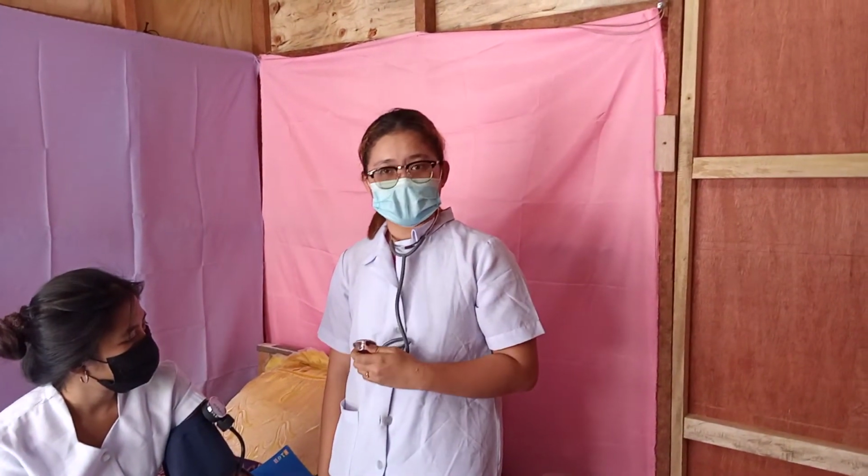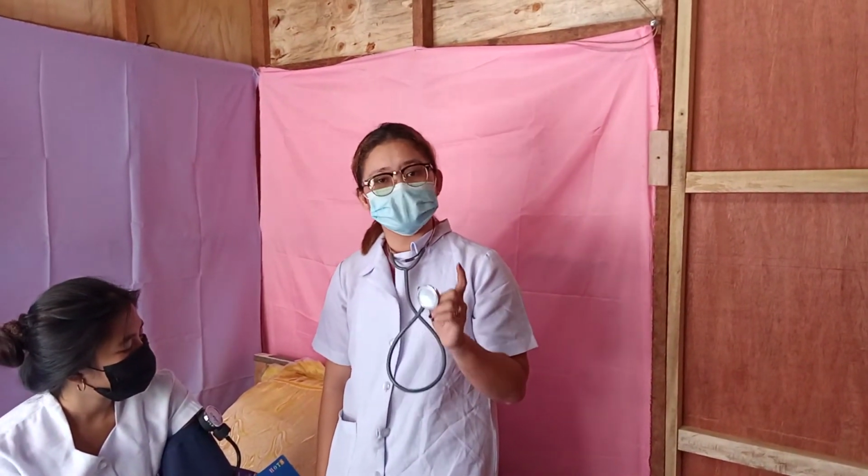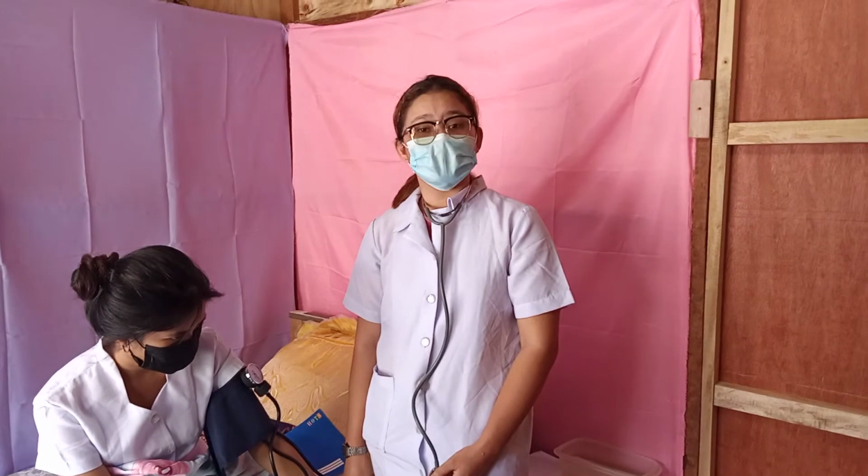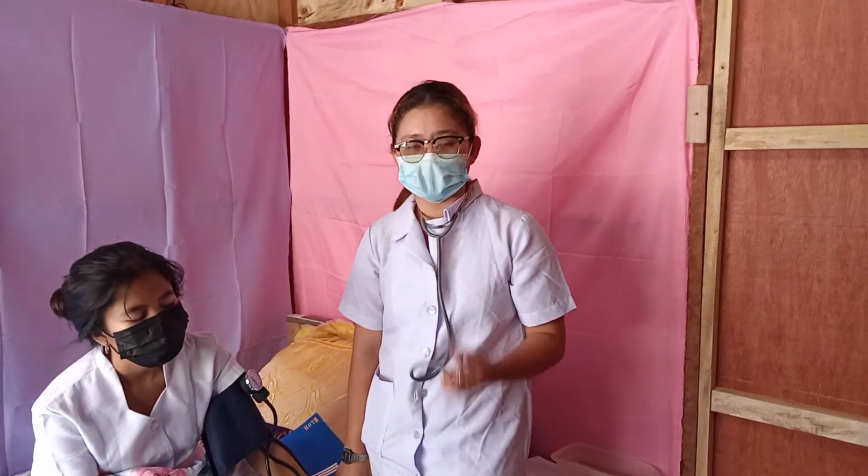After that, listen to the first distinct loud sound, which is the systolic pressure. Continue to release the air evenly and slowly. The last muffling sound is the diastolic pressure. Rationale: to get accurate results.